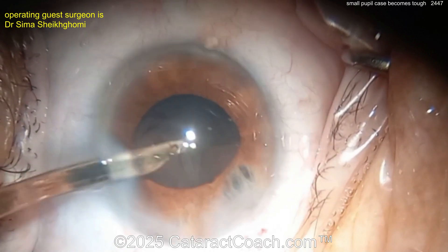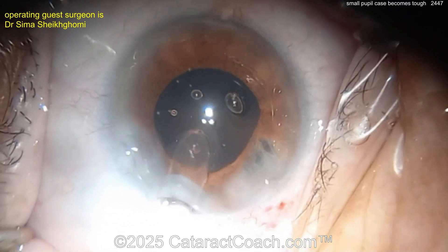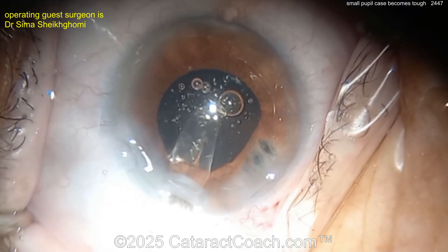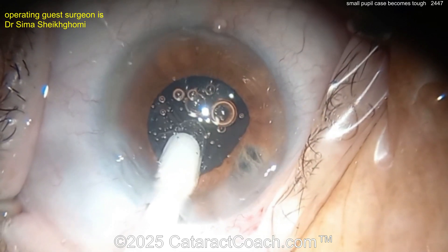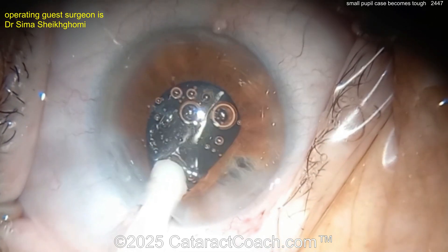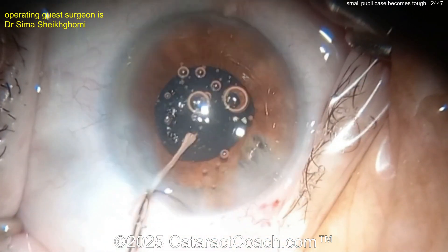You can't blame the surgeon for everything — this patient has a lot of issues: bad tissue, bad iris prolapse, bad floppy iris, a lot of Flomax-type IFIS issues. Here comes the lens going into the capsular bag under viscoelastic. That looks pretty good — make sure it's completely in the bag, especially in small pupil cases.